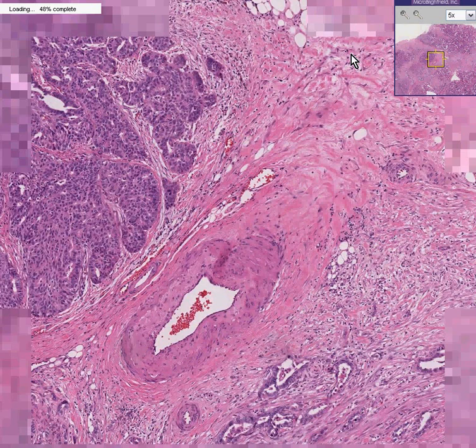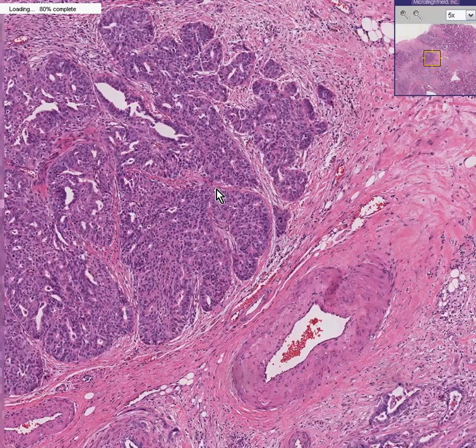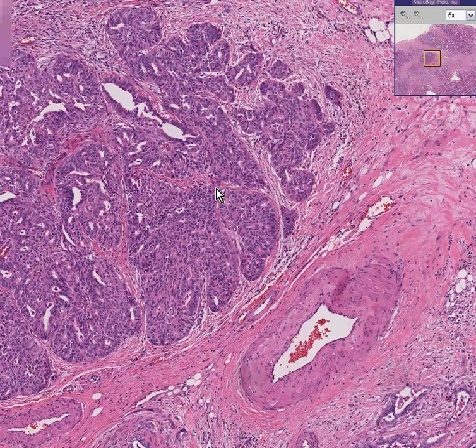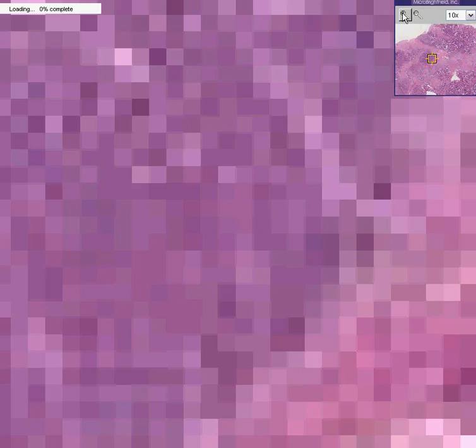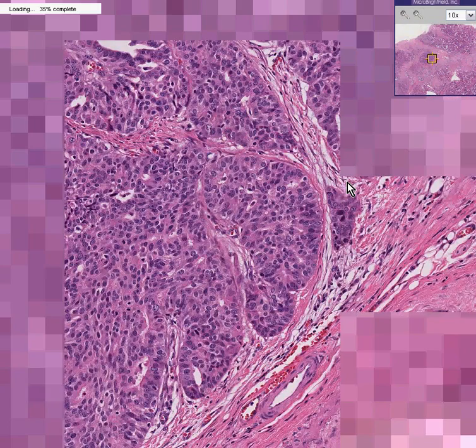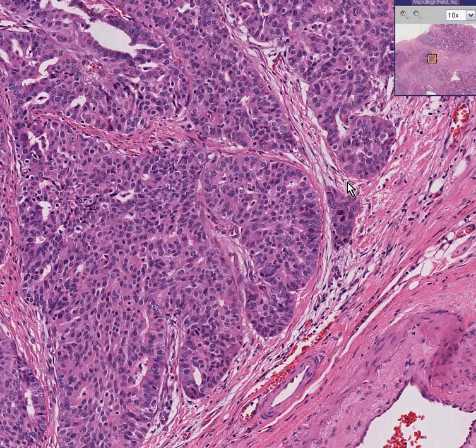And if the malignant glands took on a papillary configuration, you would also have the right to call it papillary. These are all the adjectives applied to tumors of the ovary. But the one thing you absolutely must call it, and can call it, because it is, is adenocarcinoma — because that's what just about all of the Müllerian derived carcinomas of the ovary are. And quite clearly you can see this has all the classical features of an adenocarcinoma.